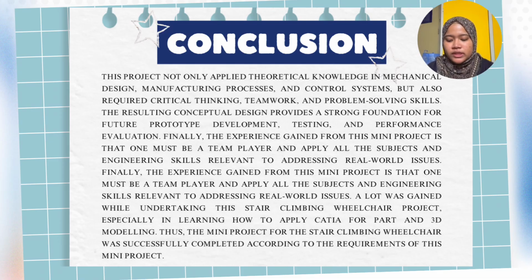So the project applied theoretical knowledge in mechanical design, control systems, and CAD modeling using CATIA, while also enhancing teamwork and problem-solving skills. Overall, the project met its objective and provides a strong foundation for future development and improvement.